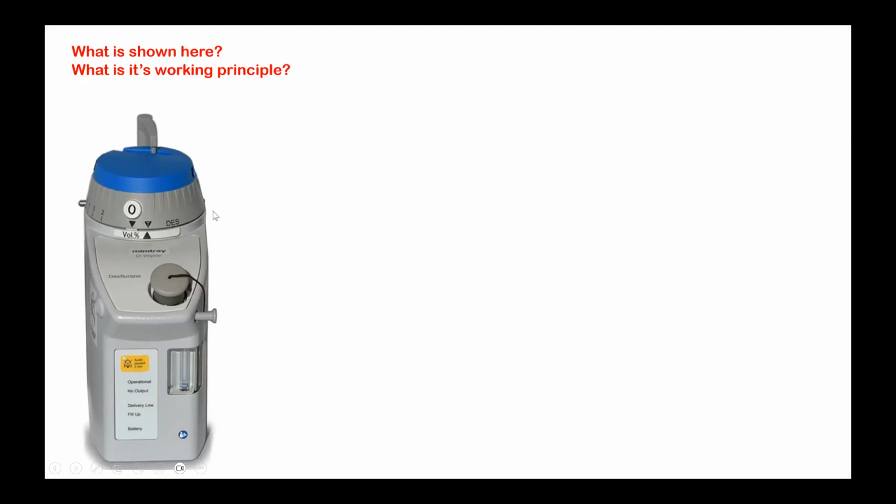This is the desflurane vaporizer. All of you have seen this?